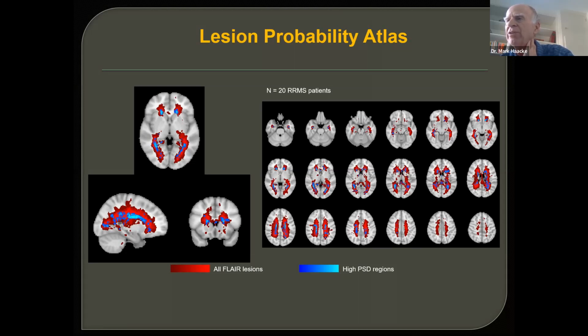And so it's going to take longer to get that blood flow out. And over a period of 10 or 20 or 30 years, that might lead to late onset MS, for example. Yes, when you do perfusion imaging with contrast agent, we measure cerebral blood flow, blood volume, and MTT. The MTT, the mean transit time, is actually the most sensitive, and it's used in stroke all the time to map out any flow abnormalities. So yes, I highly recommend that if you are getting a contrast agent, you make sure they do a PWI scan. It only takes like an extra 2 or 3 minutes.